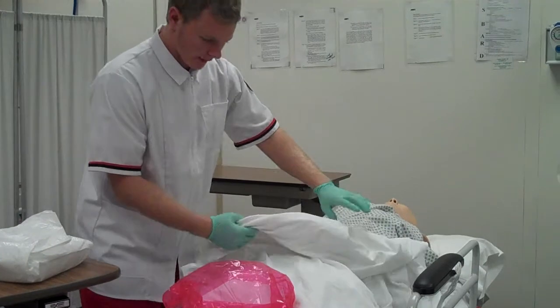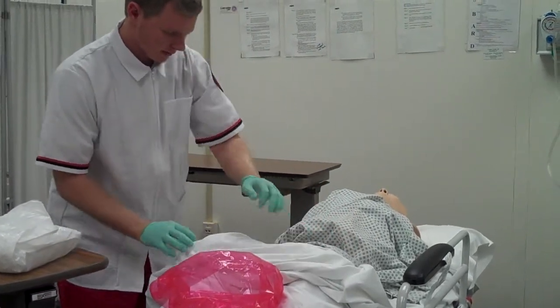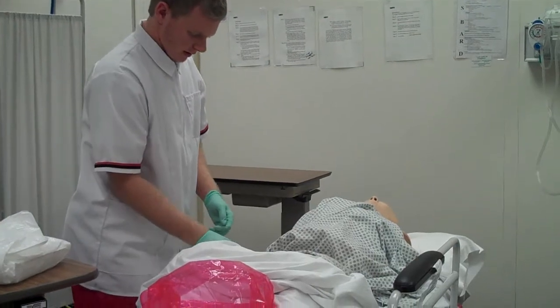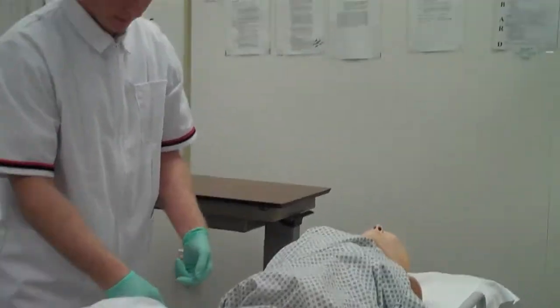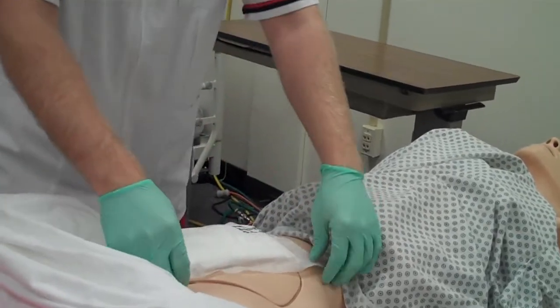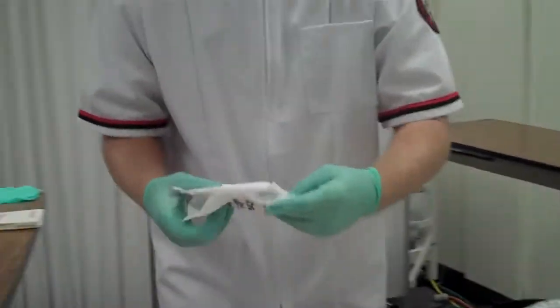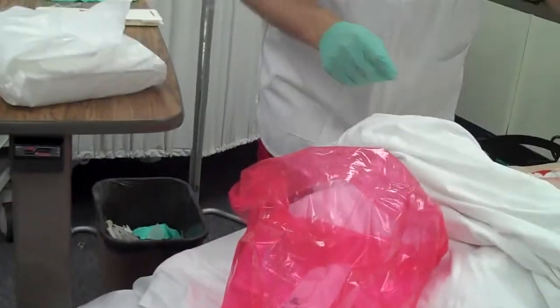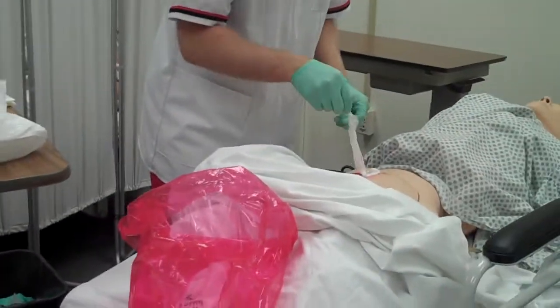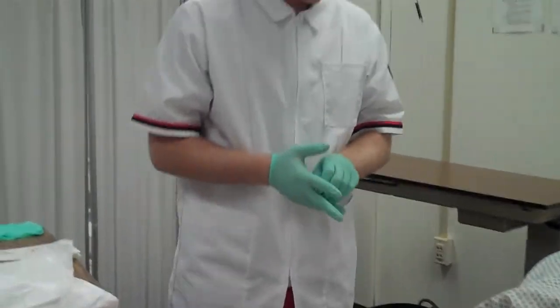Just going to pull your blanket down. I'm going to take the dressing off towards the wound to prevent it from hurting. Get that. Dispose of that.